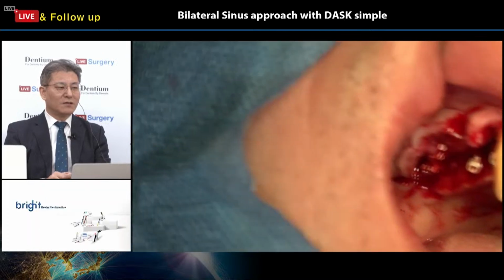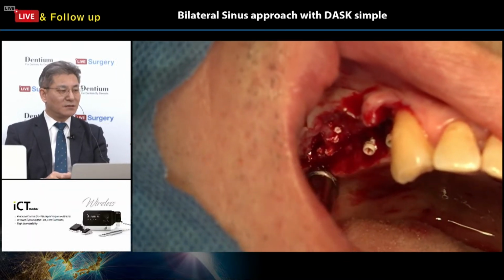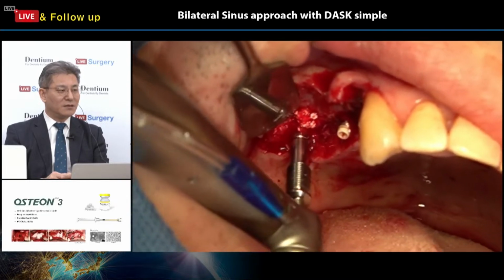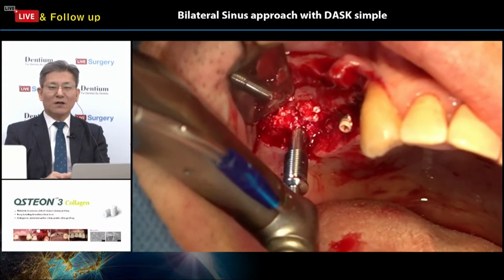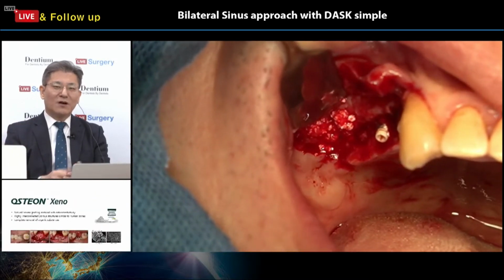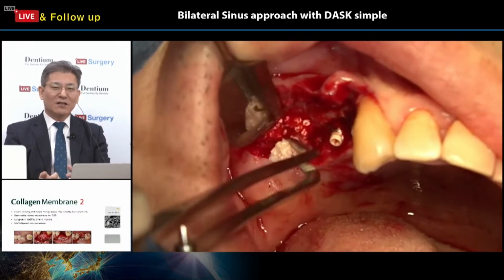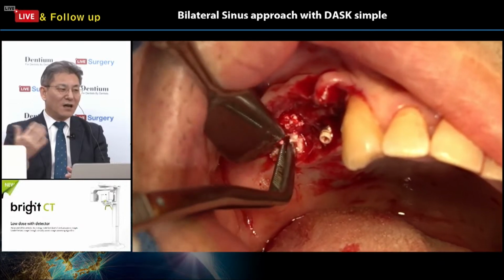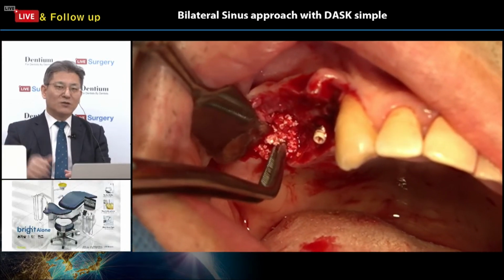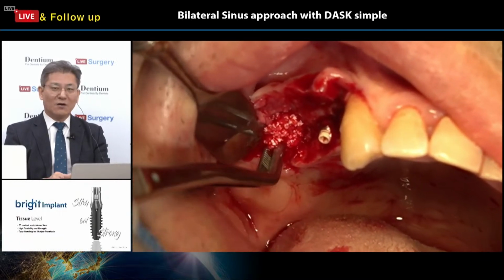Yeah, good, so far so good. As far as I know, there are many big names in sinus elevation, like Dr. Chung. They prefer the crestal approach to the lateral one now. Why?